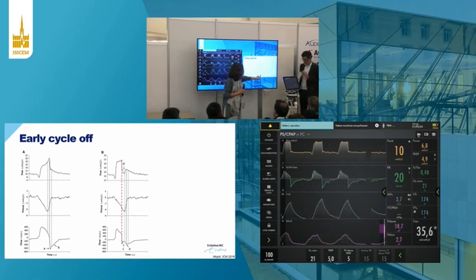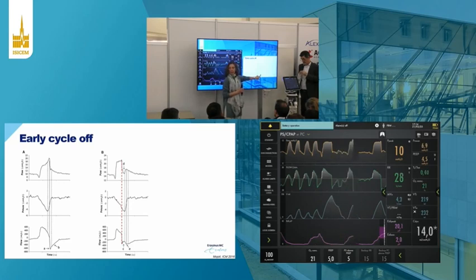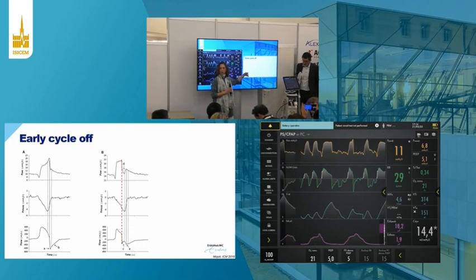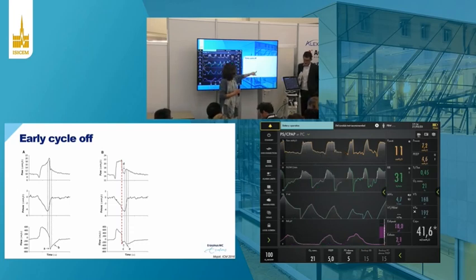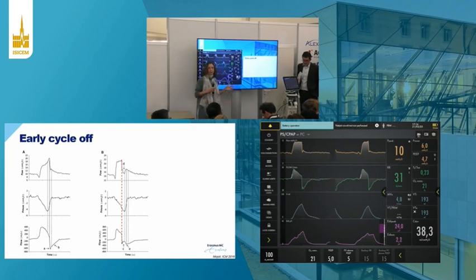What you can see is this: the patient is still inhaling, so after the opening of the exhalation valve, the flow, instead of becoming expiratory, tends to go towards inspiratory, but doesn't fully reach the level of triggering. It doesn't become inspiratory. And you see the pressure in pressure support mode rising again. So this is actually the same problem, but not to the same extent.